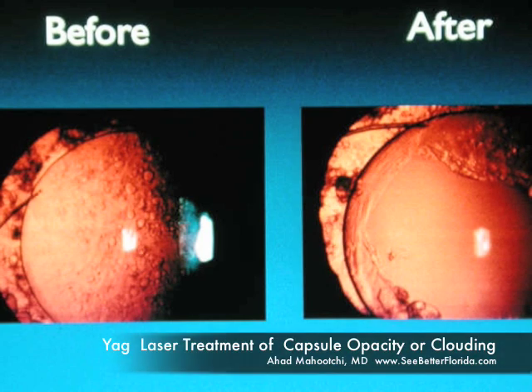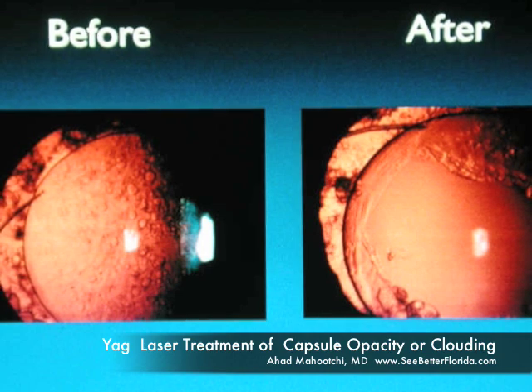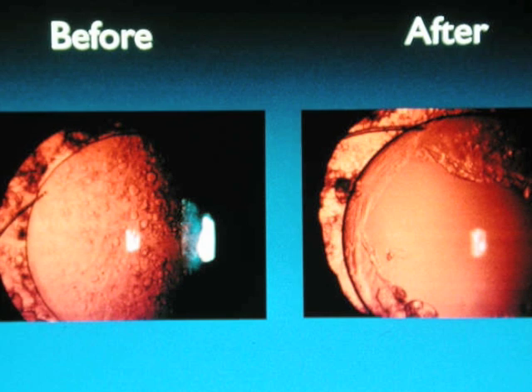Here's another toric lens that we're treating. The capsule has become very thick, and we're using the laser — focusing the red beams on the posterior capsule — to treat it. We'll open it up here. Now you can see the post-operative result: there is the lens implant with a clear view to the back. And that's what the lens looked like before treatment — a big difference.